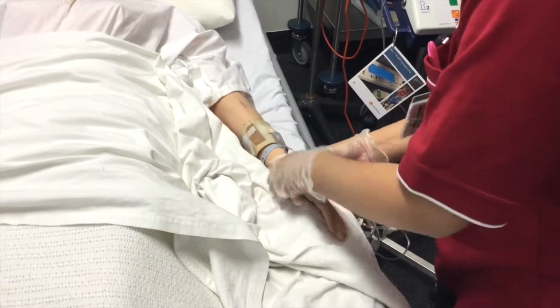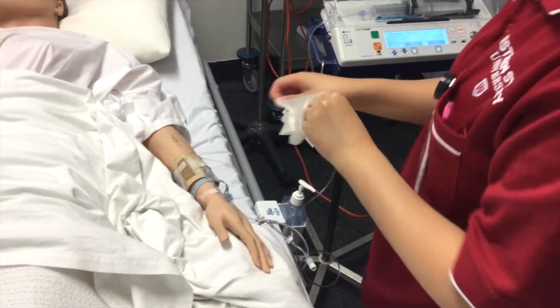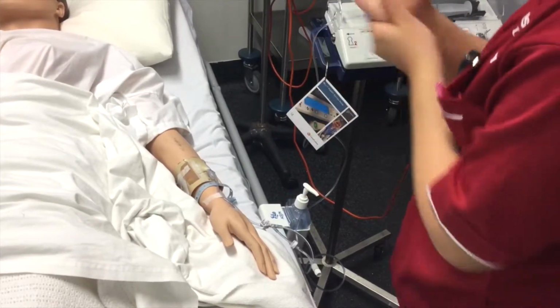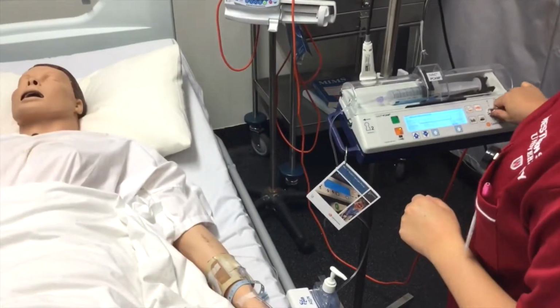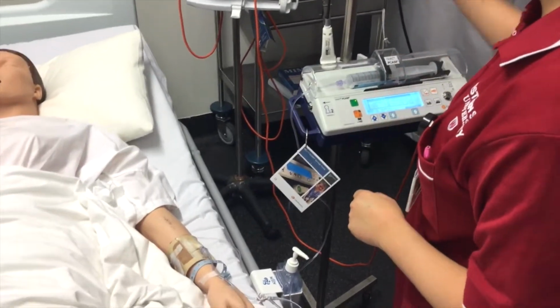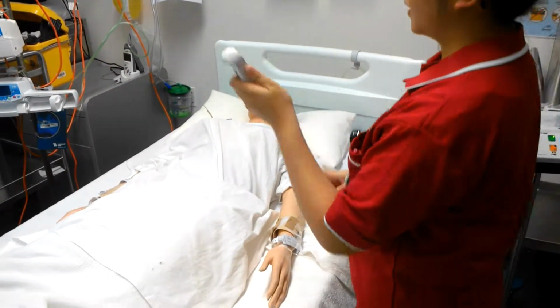Okay, so Miriam, the medication's now attached to you. What I'll do is I'll explain how to use it as well. I'll turn it on first and remove the key. Okay, and I'll explain how to use this. So you will have this button to press.